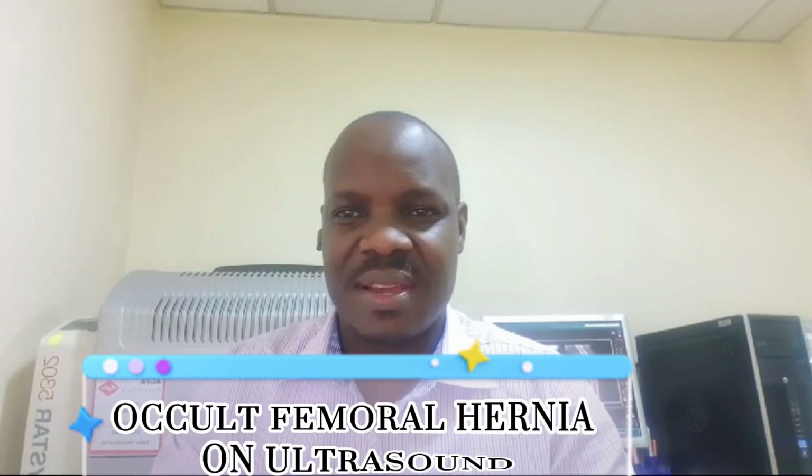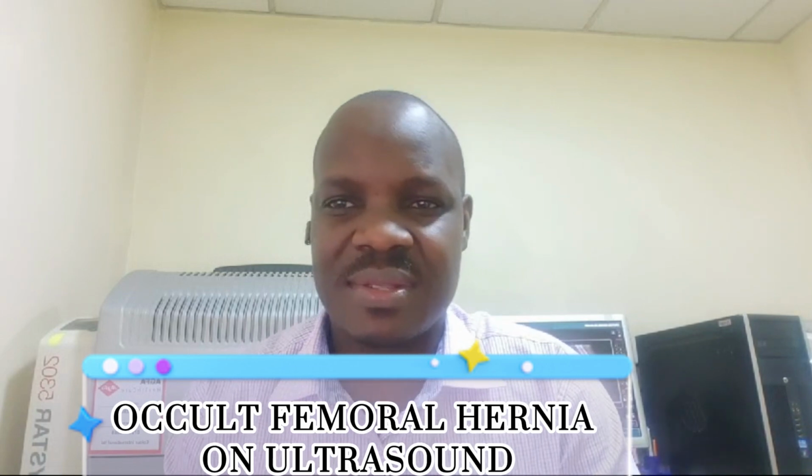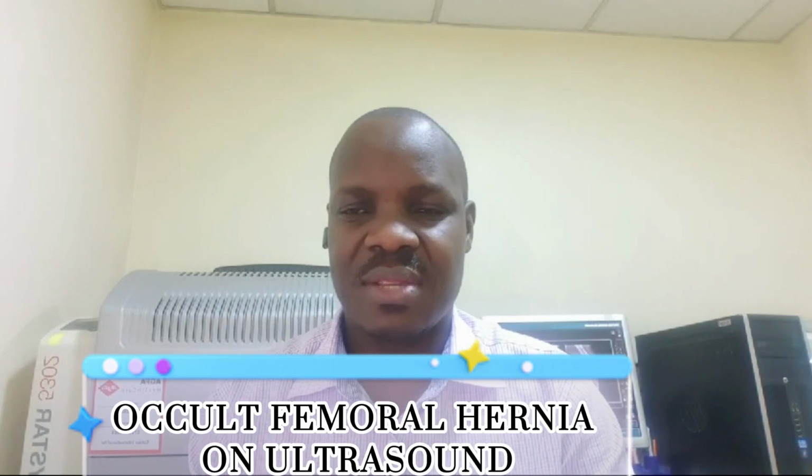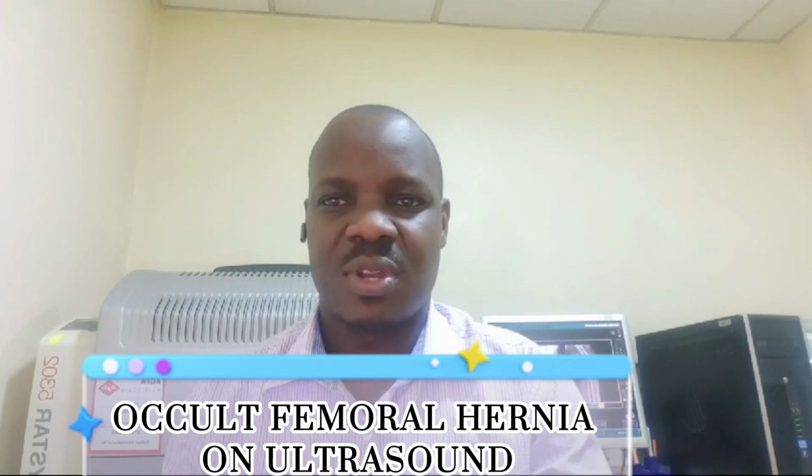Let's talk about something called an occult femoral hernia on ultrasound. Let's define what an occult femoral hernia is. This is just an opening or a defect that develops on the anterior abdominal wall at the femoral region, an opening where sometimes you find intestines or omental fat protruding through the opening.